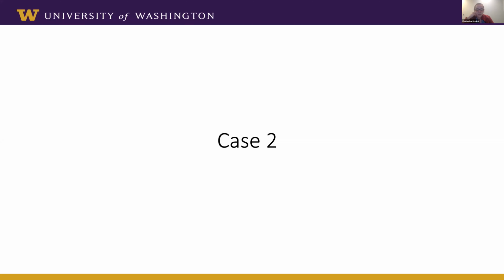Whereas with the left, we use pretty large guides. So this was an EBU 4. We pretty standardly use EBU 4s from the wrist. You know, once you get it in, it's gonna sit pretty well, and you don't have to be quite as active with the guide.